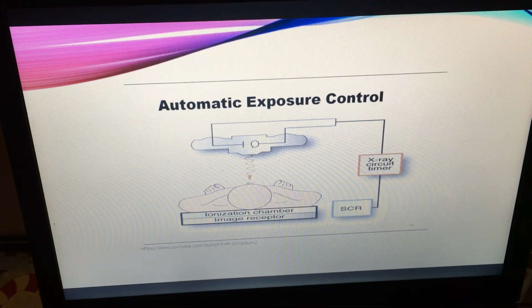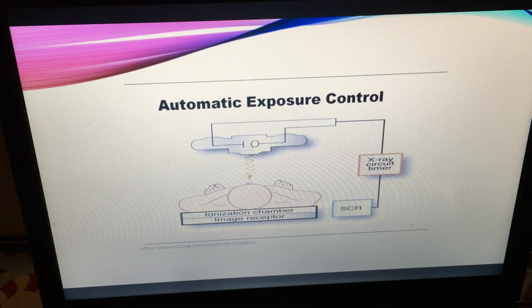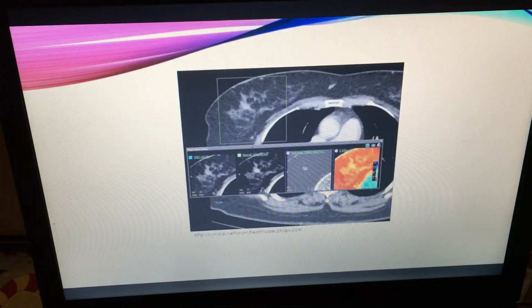There are significant disadvantages to using bismuth shielding. If the shield is not applied properly, it can actually increase patient exposure because of the AEC detectors. In the study of CT gradient attenuation induced by shielding, it showed that there was a correlation between bismuth shielding and increase in Hounsfield units.